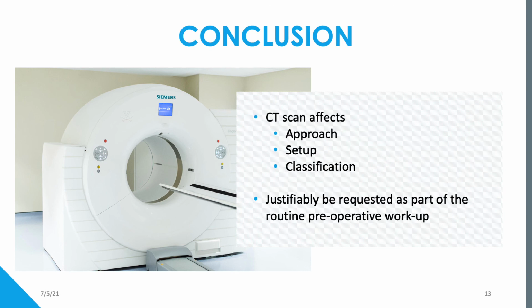We can therefore conclude that CT scan does affect the approach, the setup and the classification, and justifiably can be requested as part of the routine preoperative workup in these injuries.